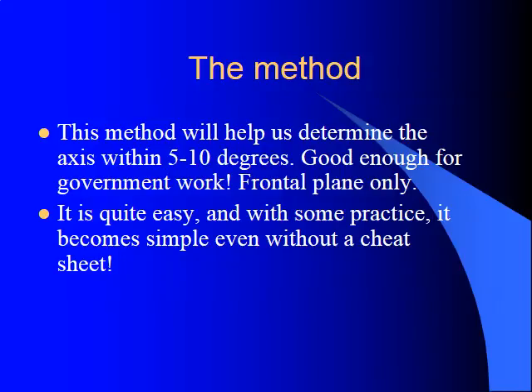This method is going to help you determine the axis within 5 to 10 degrees. This is good enough for anything that we're doing. It is for the frontal or vertical plane only. It is pretty easy. You don't even need the cheat sheet after you do it a few times.